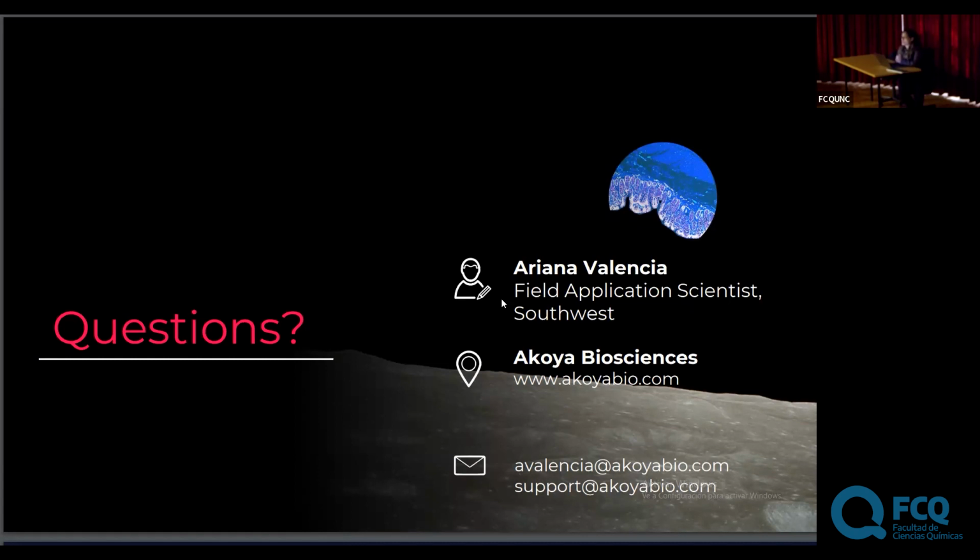I'm wondering whether we can use it with cells. You're able to fix them, then it will be. Cells work too. We have a lot of TMAs, tissue microarrays with cells. You just get the core from the block and you're able to cut it onto a slide. I will warn that if you create blocks using cells, once you keep cutting, you'll get less and less. So just have multiple blocks. But somehow you have, let's say, a cell suspension, and you somehow fix it on the slides. Yeah, we have a lot of people do that.